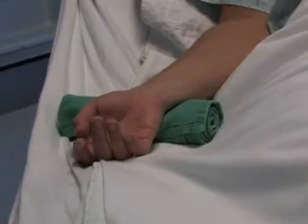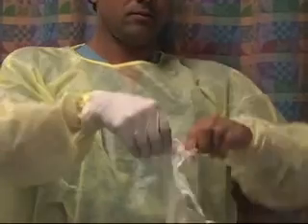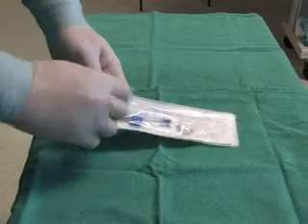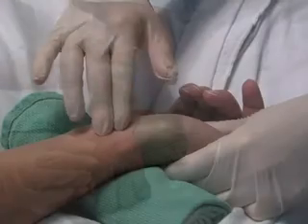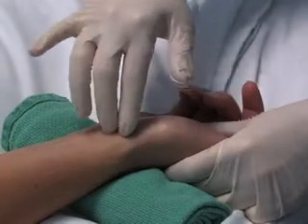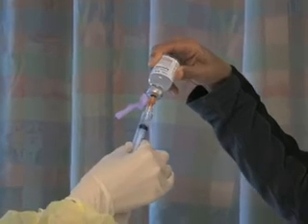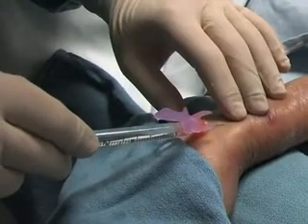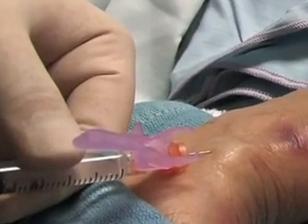Extend the patient's wrist and place a rolled towel under it to maintain the extended position. Once positioned, put on a non-sterile gown and gloves. Open the arterial blood gas kit and identify all the components so they are ready for use. Clean the site with an alcohol swab. Palpate the radial pulse and determine the point of maximum impulse, or use the Doppler ultrasound to identify the location of the radial artery. Using the 5cc syringe and small needle, draw up 1% lidocaine. Upon introducing the needle under the skin, draw back on the plunger to ensure you have not punctured a vessel. Inject a small wheal of analgesic around the artery and wait 30 to 60 seconds for the lidocaine to take effect.